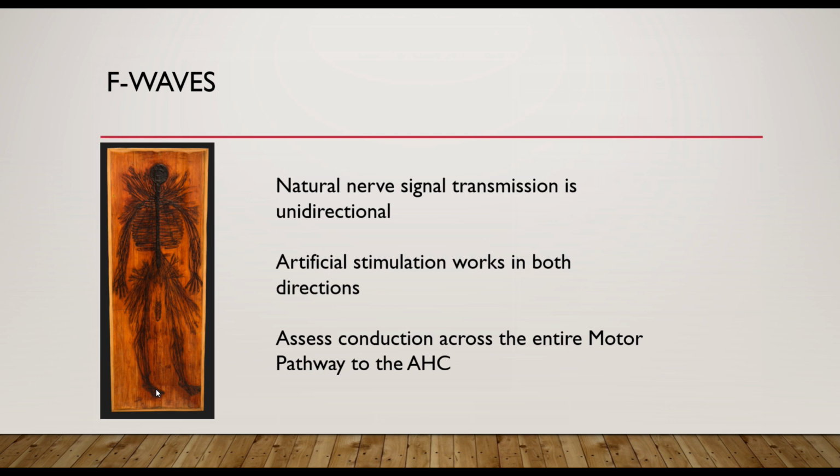Roughly about 10% of the anterior horn cells will be stimulated by doing that, and one will therefore get an after contraction of about 10% of the entirety of the contraction.